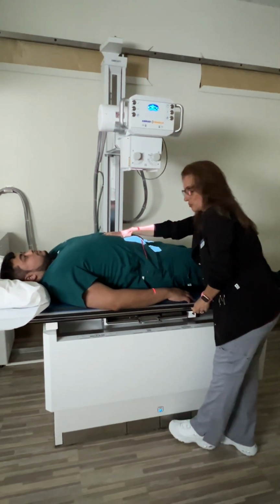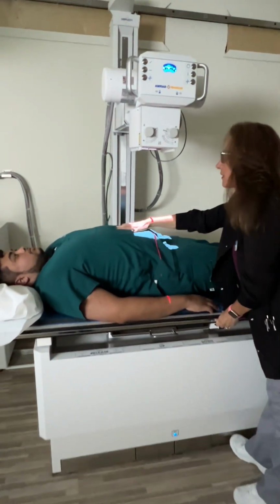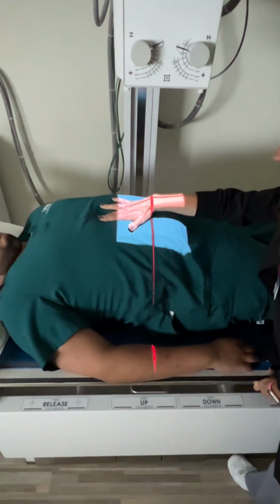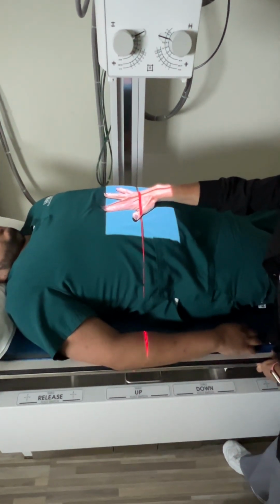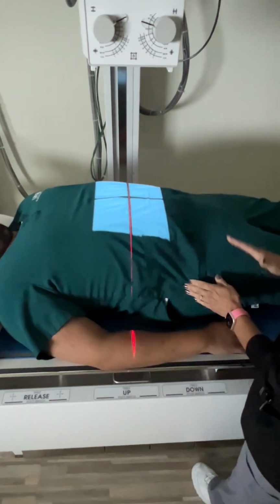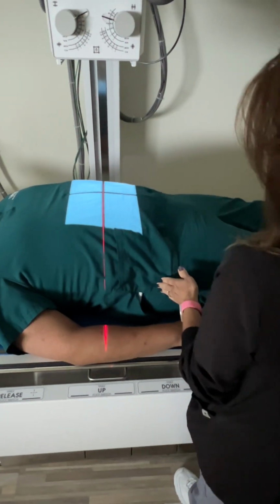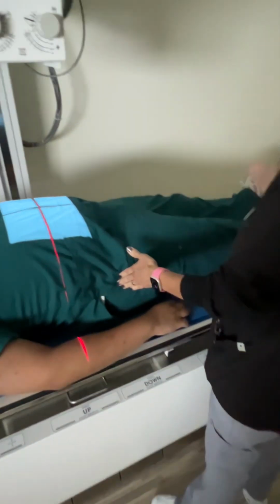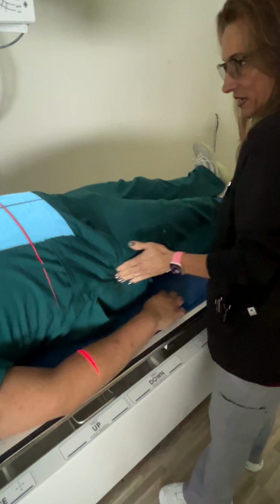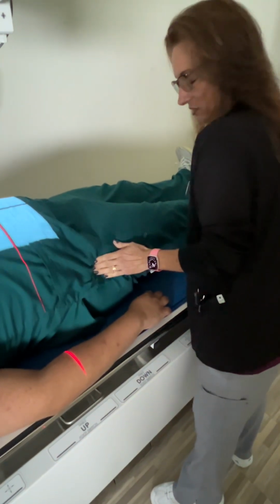So central ray on a supine abdomen is midline, which means in line with the xiphoid process. And then the bottom image has to capture pubic symphysis. So pubic symphysis tends to be aligned with the greater trochanter. So I'm gonna palpate for greater trochanter.